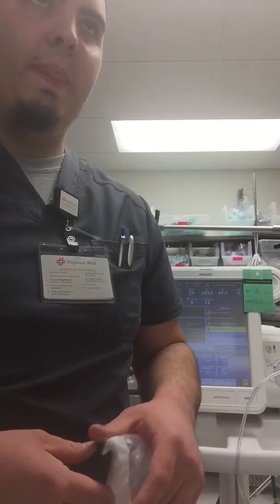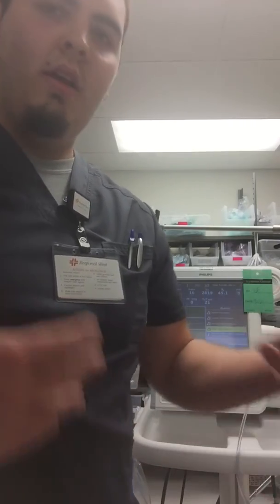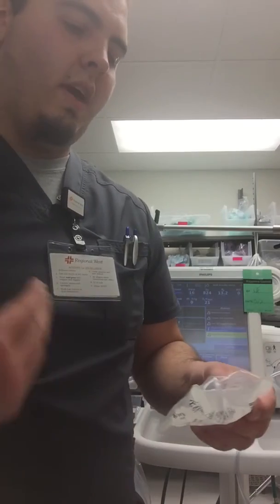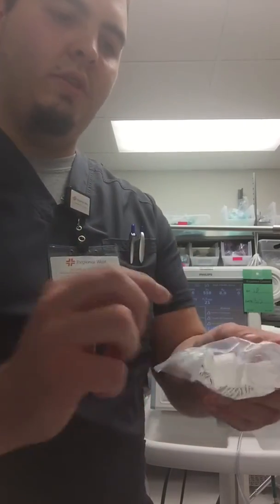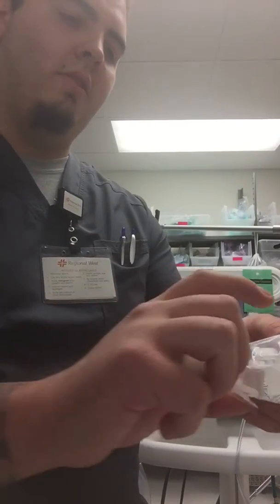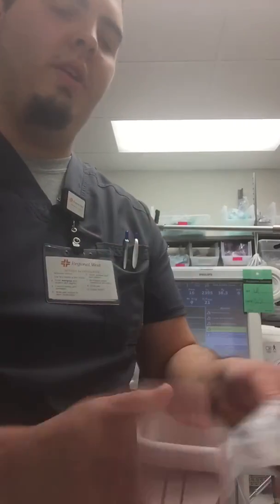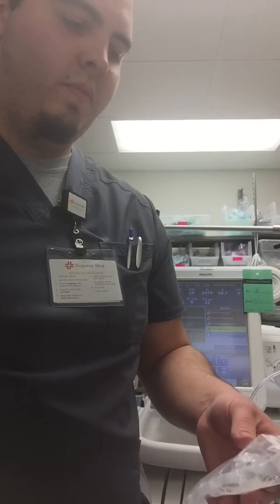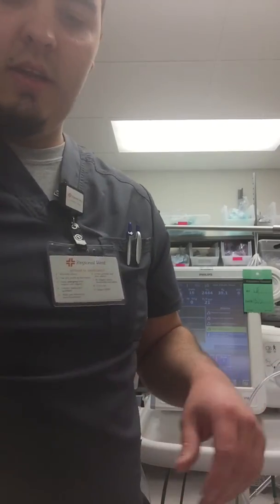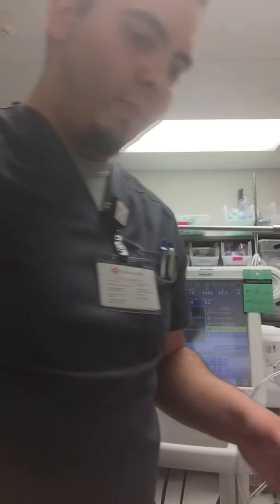And then you're gonna wait that 30 seconds to a minute, allow that to settle in, them to breathe, and then you're gonna do it again. Just keep it in there, and then inspiratory hold, spray, coordination. That way, they're still getting that medicine, and everything turns out just fine.